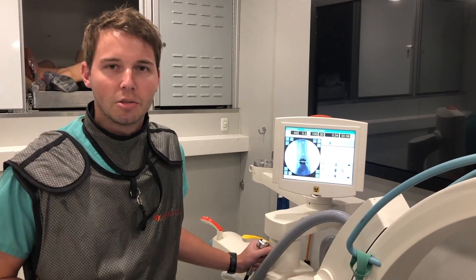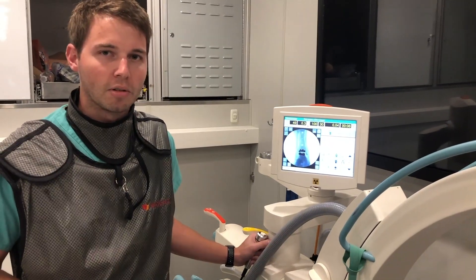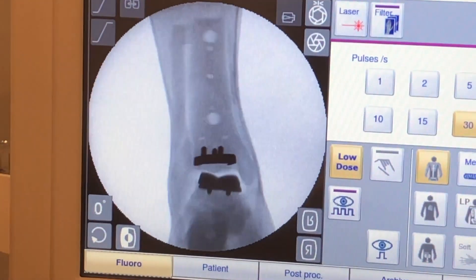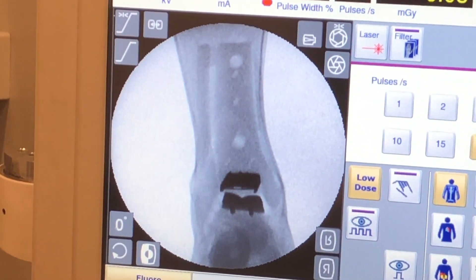However, with today's technology we have total ankle replacements. I'm going to show you on the x-ray here what a total ankle replacement looks like and how it functions. As we move the ankle up and down you can see the two metallic implants which function to resurface the joint.